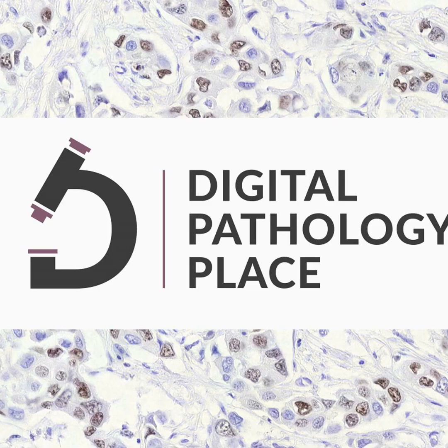This adage is particularly poignant in the realm of tissue image analysis. If the algorithms are irresponsibly designed or based on inferior or inadequate images, for instance, images with an excess of artifacts, or if inconsistent and poor quality annotations are provided, the results will be fundamentally flawed, rendering them essentially unreliable.